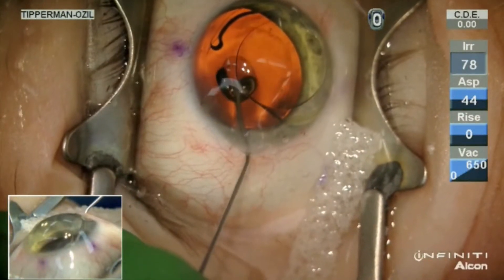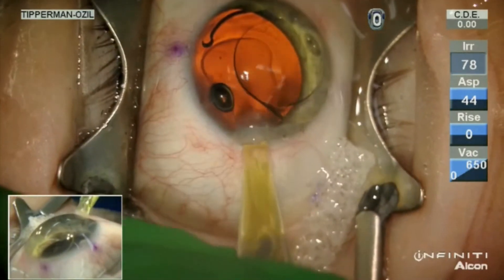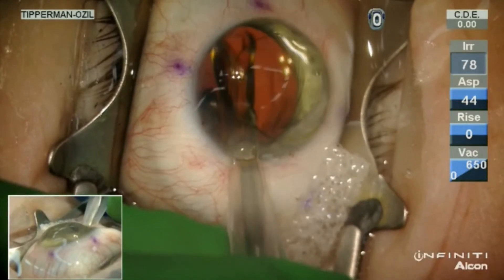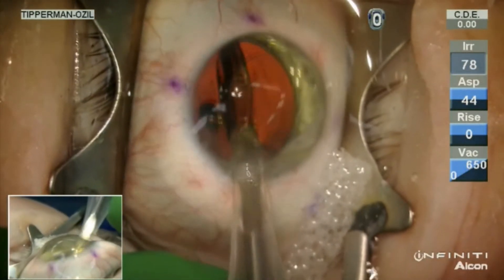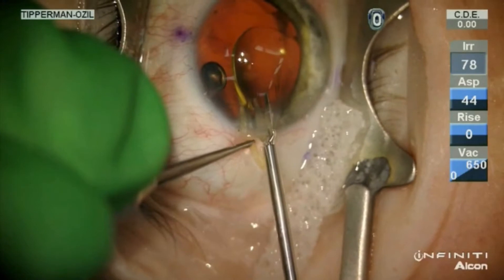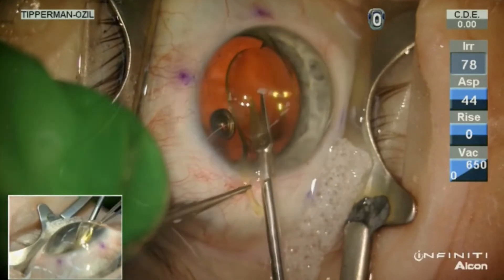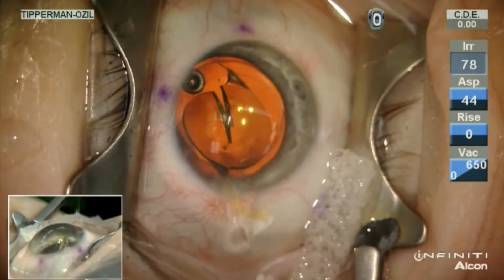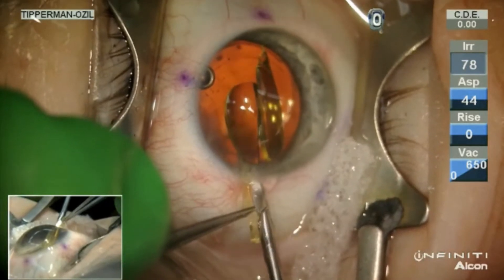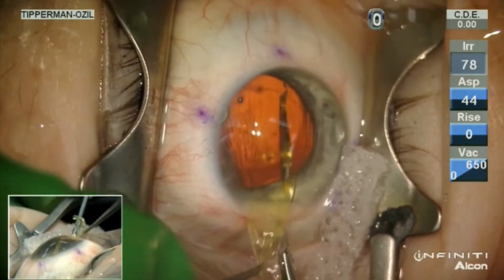Here's another technique shown by my partner Dr. Rich Tipperman, who performed this exchange during live surgery at an ASCRS meeting. The toric IOL is already lifted up into the anterior chamber, and he put the new implant in the capsular bag before the old lens even came out. This keeps the posterior capsule back so you can't mistakenly grab it with the scissor and cut it. He uses the haptic to fixate the implant so you don't push the IOL across the eye while trying to cut it. Acrylic IOLs cut much easier than silicone IOLs — silicone IOLs really get pushed across the eye and you have to hold them tightly.